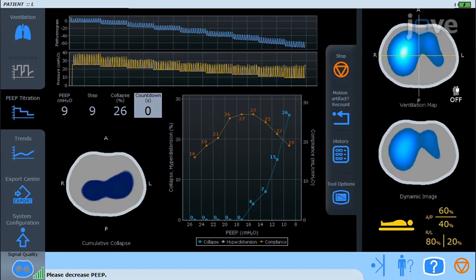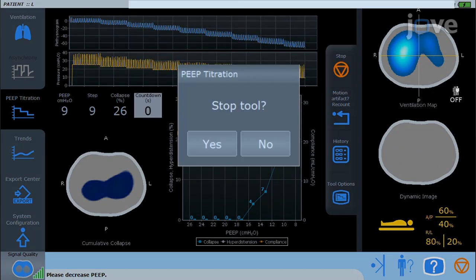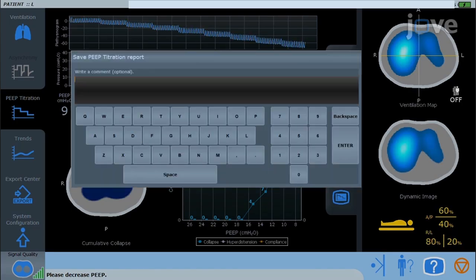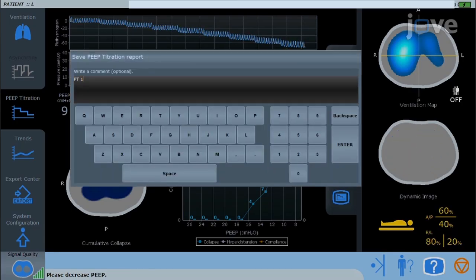Optionally, provide comments or name the titration and obtain the PEEP titration graph.